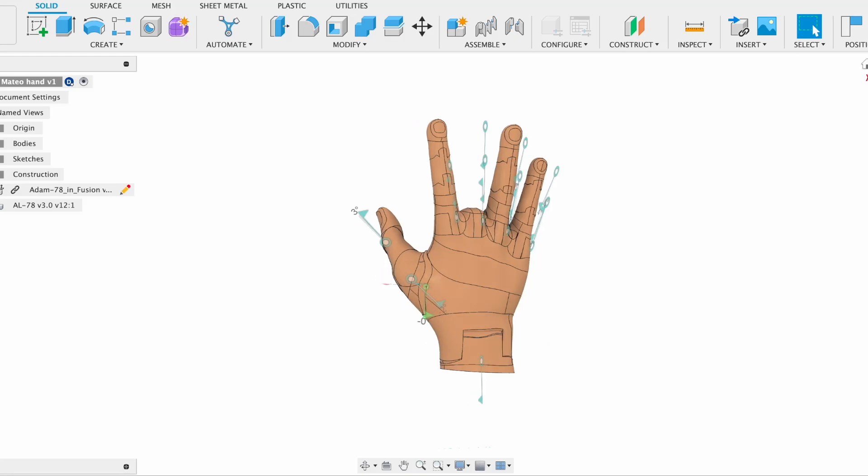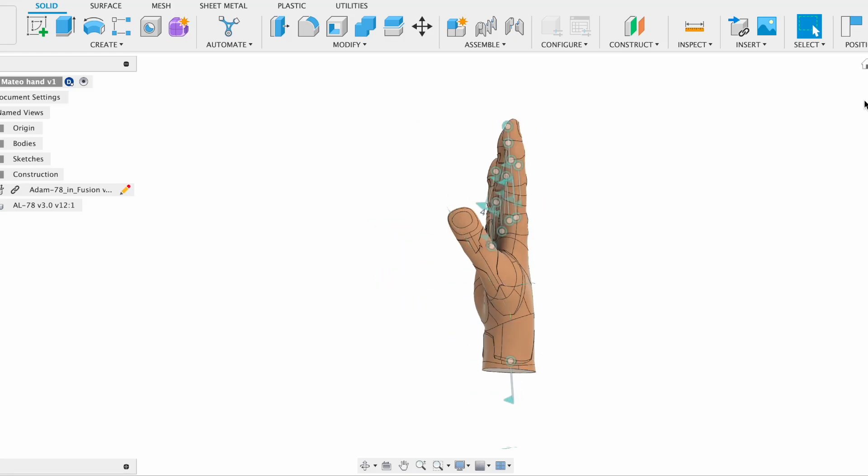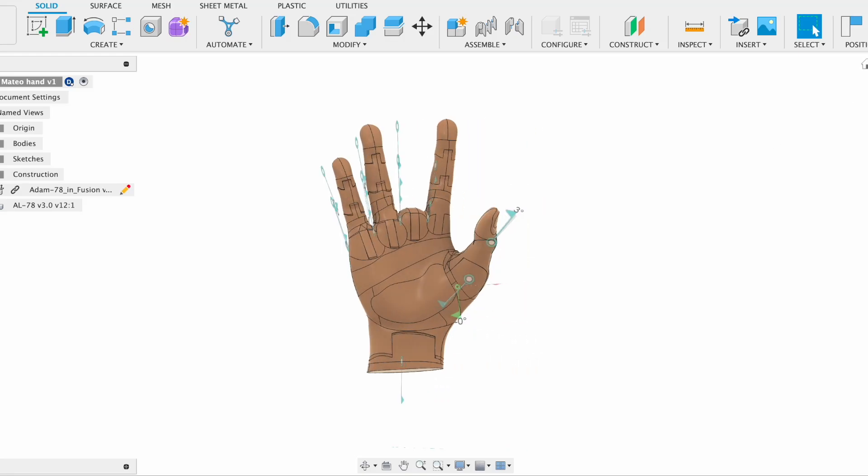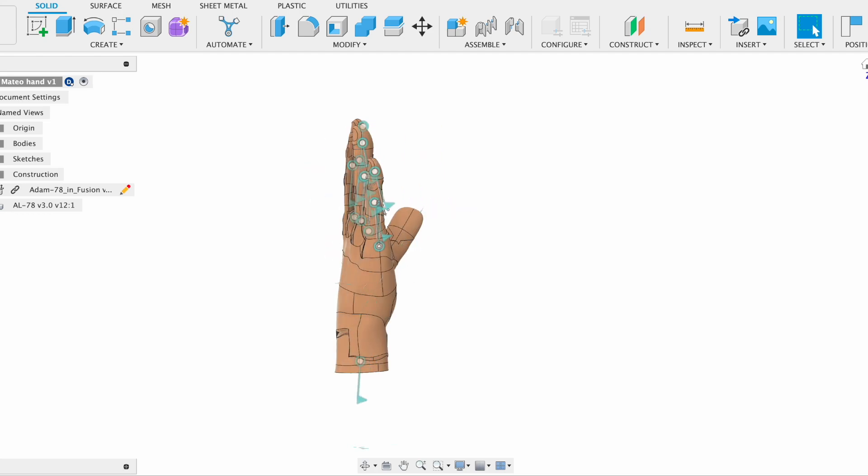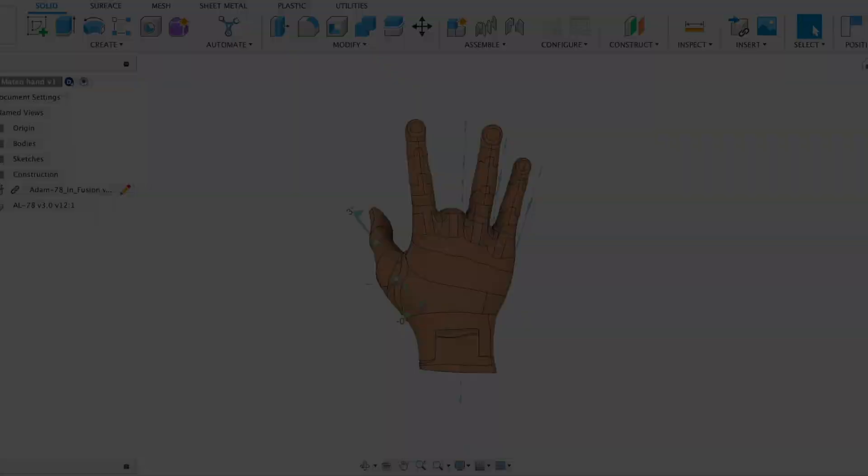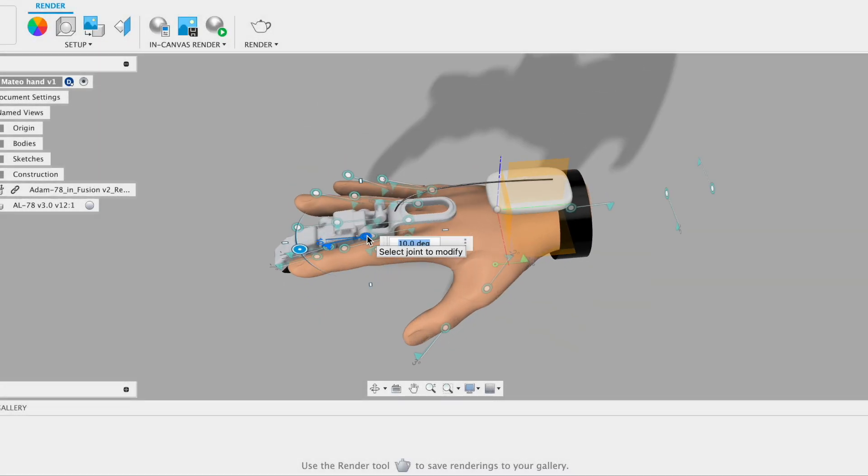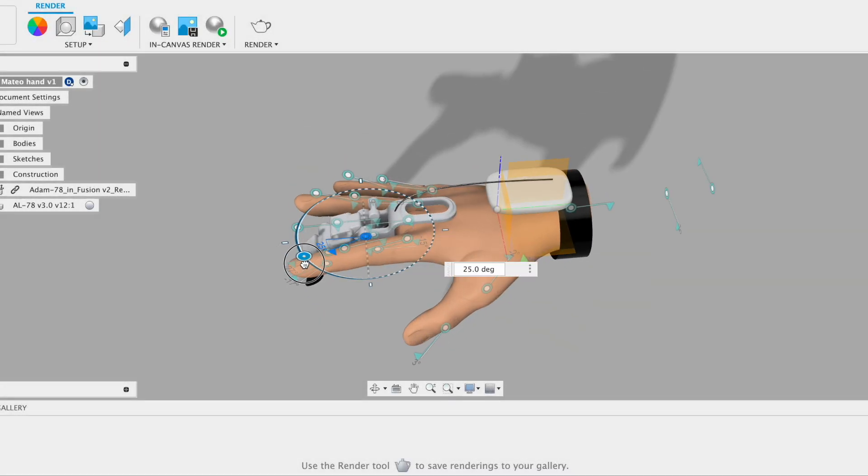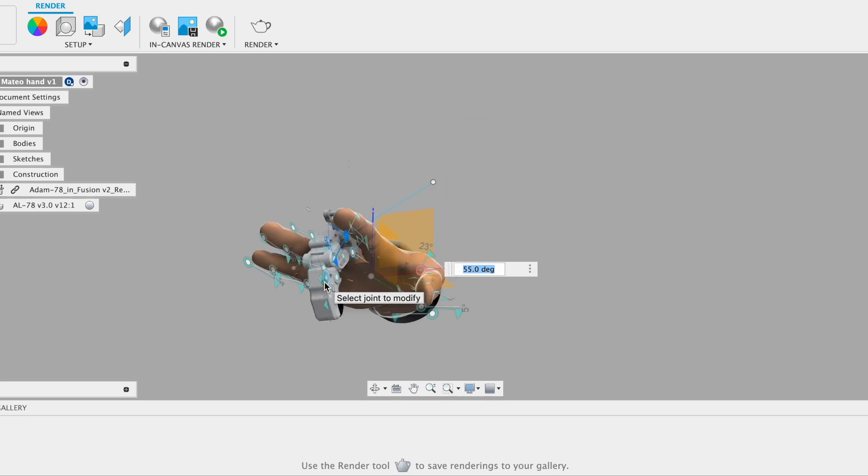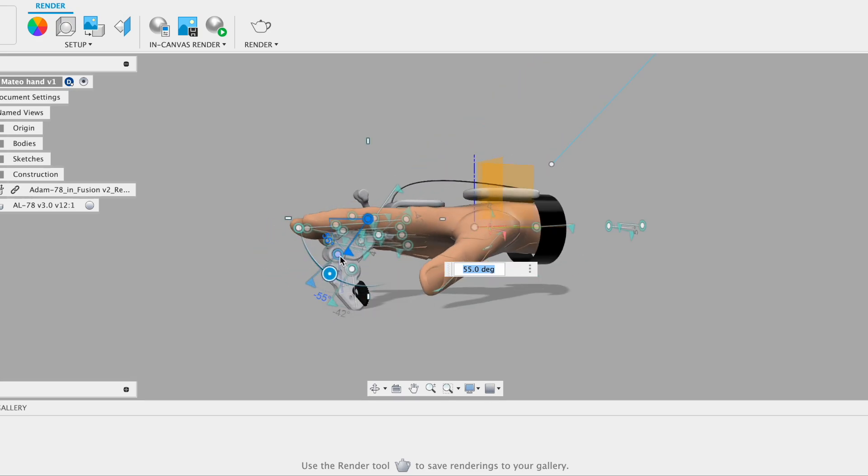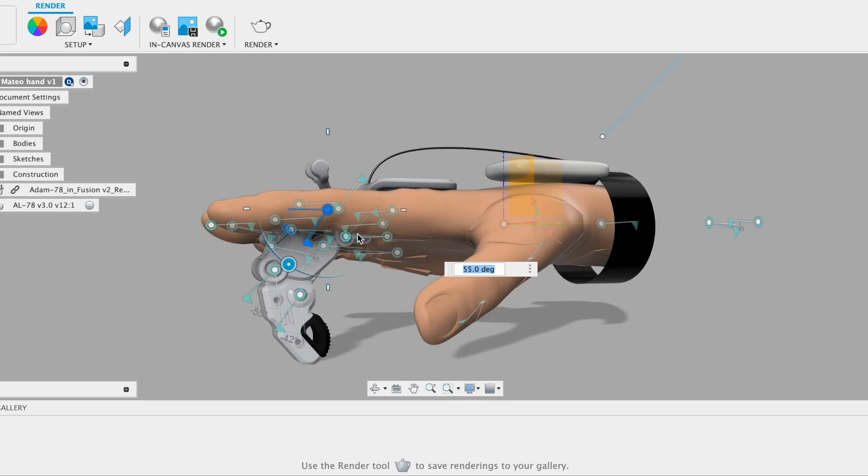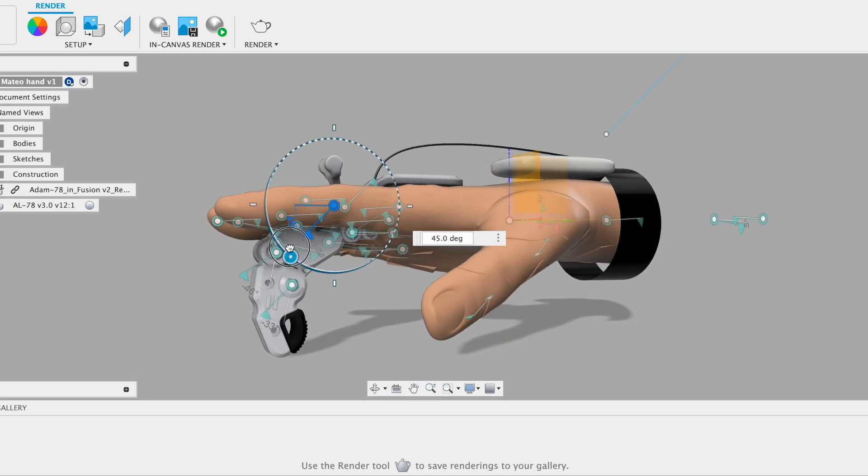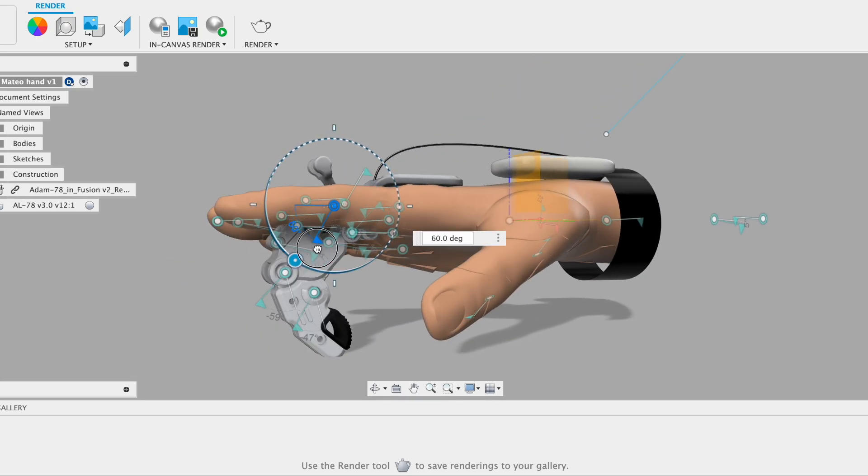Welcome back to the channel. Today we're going to talk about how we built a prosthetic finger design concept using Fusion 360. This is not about the actual design but rather making a visual representation of how it's going to look like at the end.